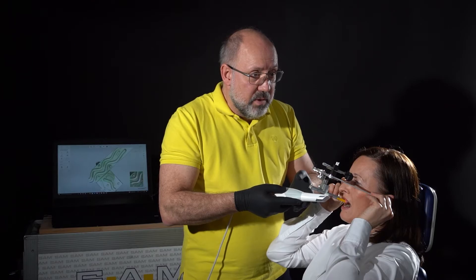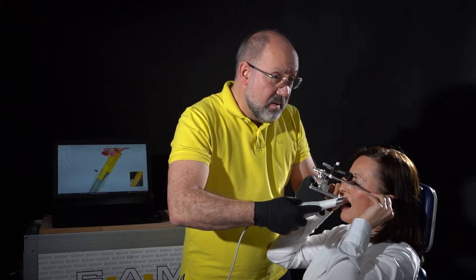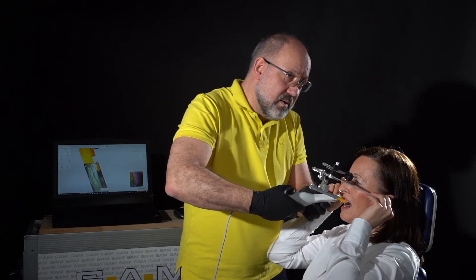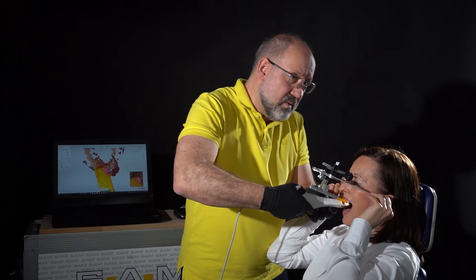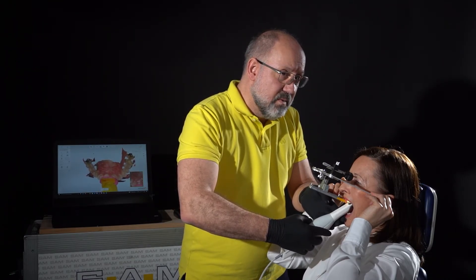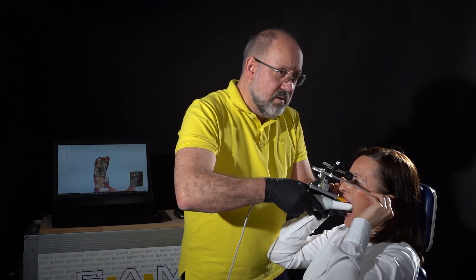Very important here is this angulation between the rod and the block. I can go back here, maybe on the other side, and check for the good connection.